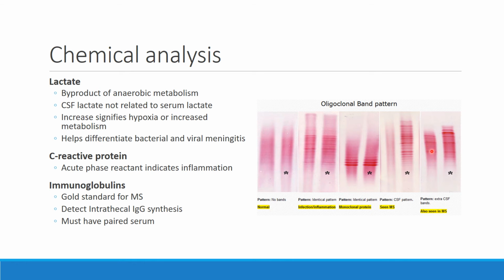And those are those dark lines. So some of the Ig clones are definitely being produced at a higher rate. And those have patterns or pairs at the same rate in the CSF. Well, they diffuse across, so that's not unexpected. But what the heck is this guy doing up here? It looks like a little cap or scarf on the top here.